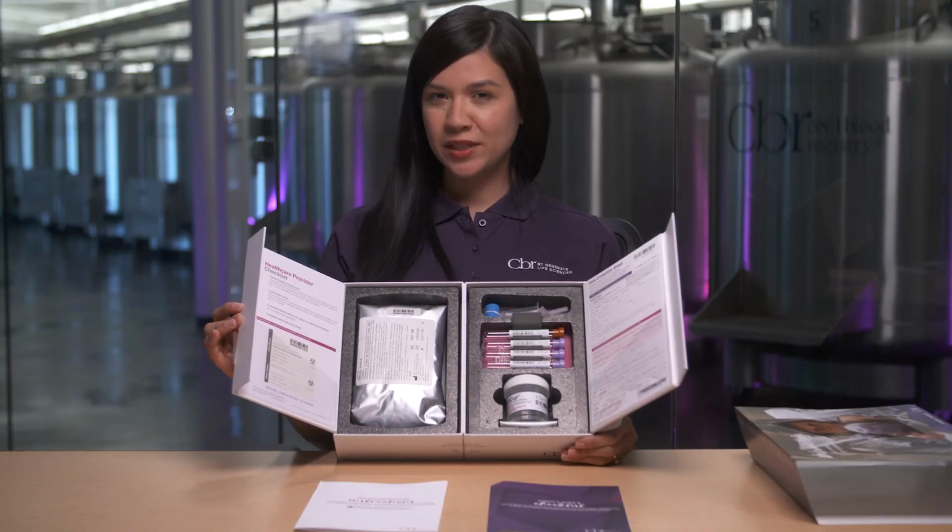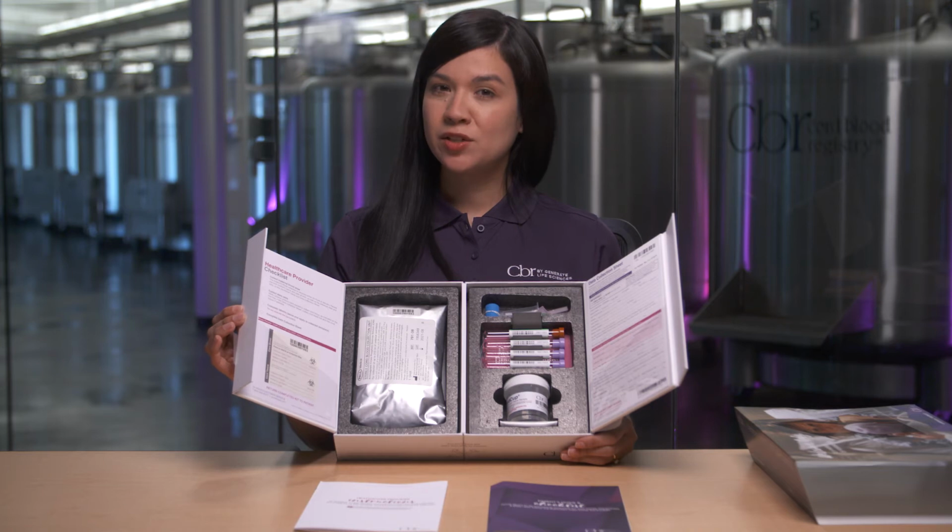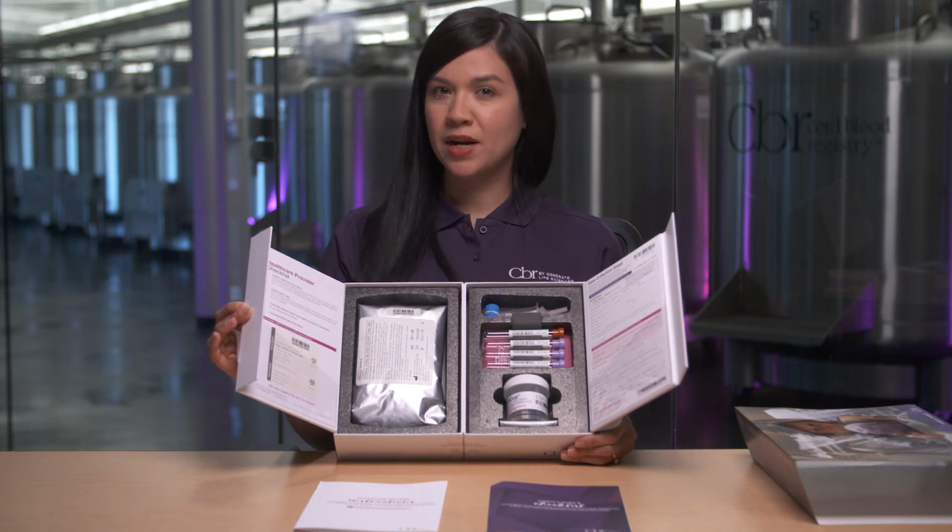Now that you're familiar with your kit, you can put it with your hospital bag for the big day. Remember not to store your kit in the car and to keep it at room temperature. When the big day finally comes, make sure you give the kit to your doctor, doula, and nursing staff. Let them know if you are going to be collecting the cord blood only or the cord blood and the cord tissue. The collection is a seamless part of the process and will happen after your baby has been born.